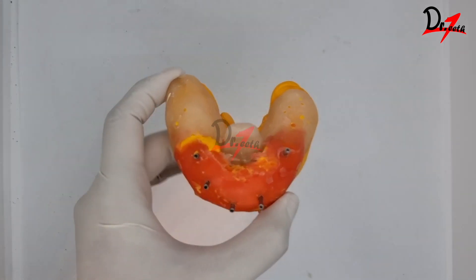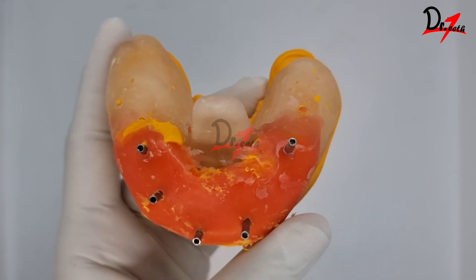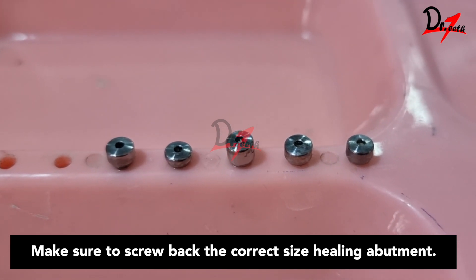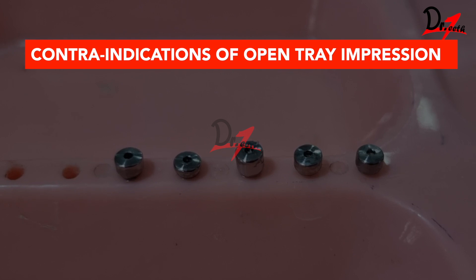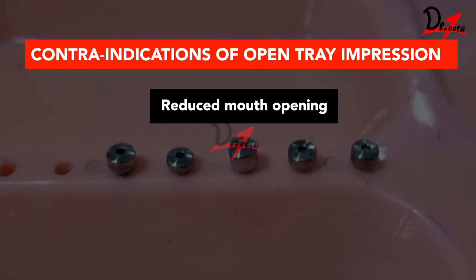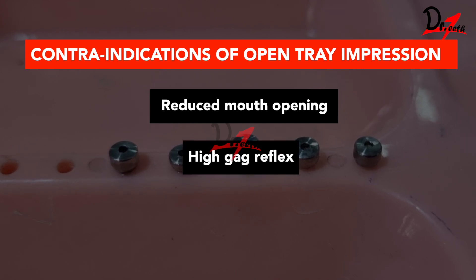The next step would be to connect an implant analog to the copings and proceed with pouring of the cast. This was the open tray implant impression technique done in cases of multiple implants and non-parallel implants. As for contraindications, patients who have reduced mouth opening — we won't be able to place those tall open tray impression copings. Also, in patients who have a high gag reflex, this technique is contraindicated.